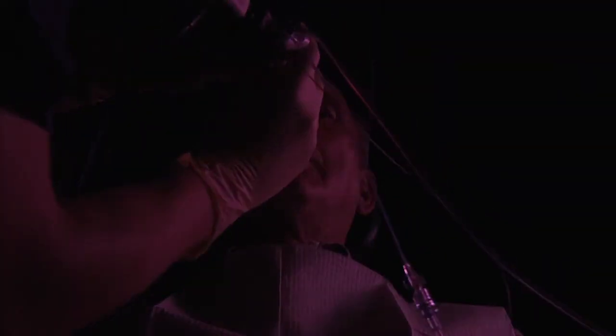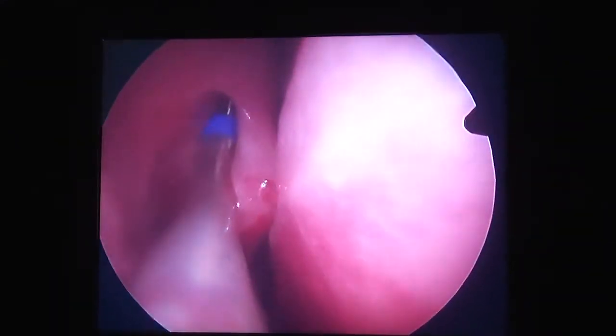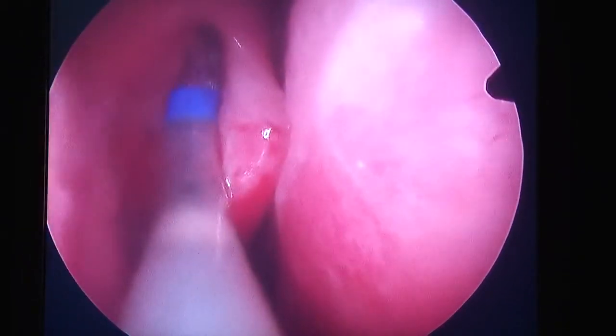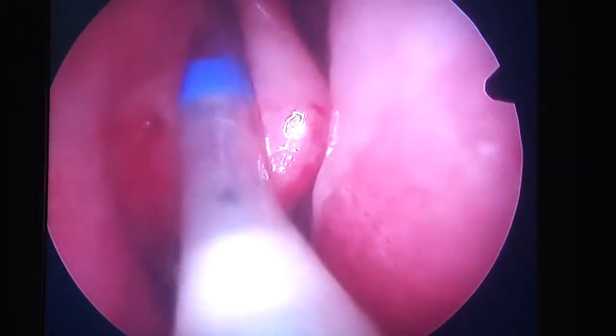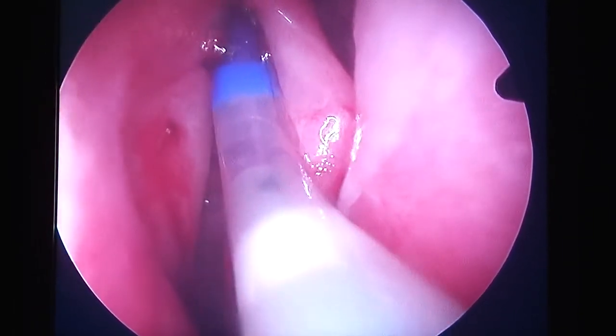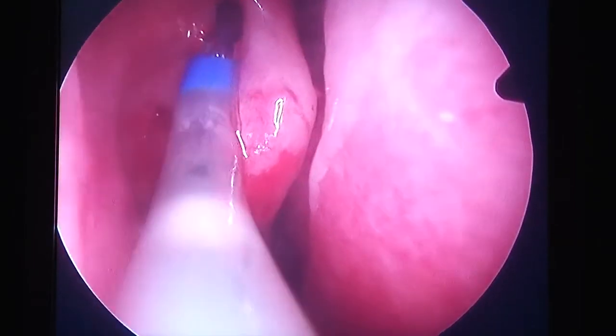We'll see if we need to move this tissue over. This one's pretty lateralized already. You're going to feel a little bit of pressure as I slide up into that area. Now I'm going to advance the balloon — Julie's going to inflate the balloon. You heard a little crunch right there — that's okay, that's the tissue moving out of the way.